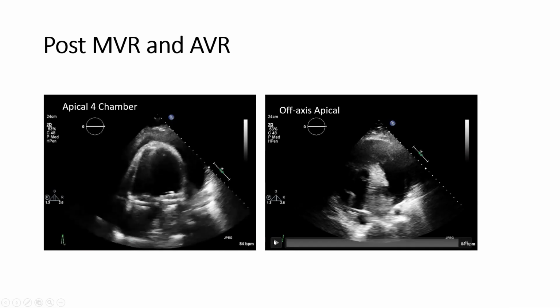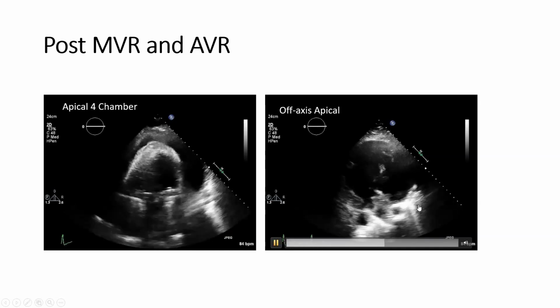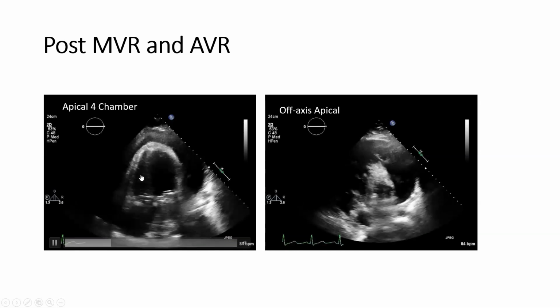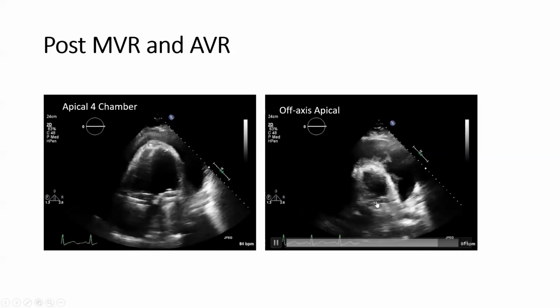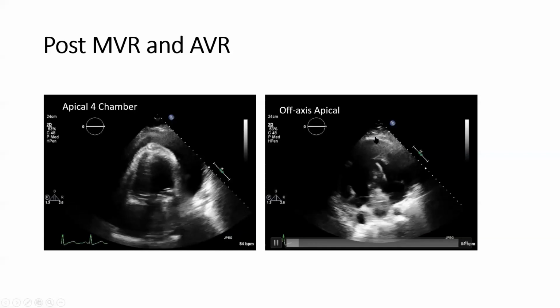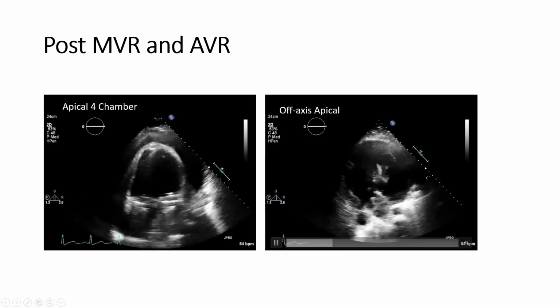And you probably know, if you attended my session yesterday, that I am a huge fan of off-axis views. So this is really an apical 4-chamber view, the clip that is seen on the left side, with a slight downward angulation. If you look at the clip at the end, you can see the 4-chamber view starting to come up like there. So these kinds of views help you decide or appreciate how large this fluid space is beyond the apex, at least, left to right dimension.